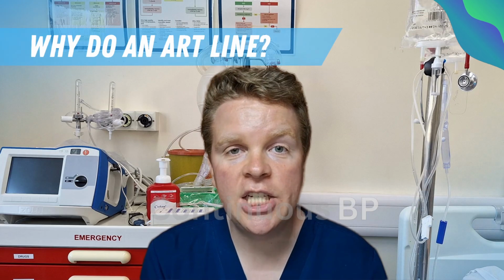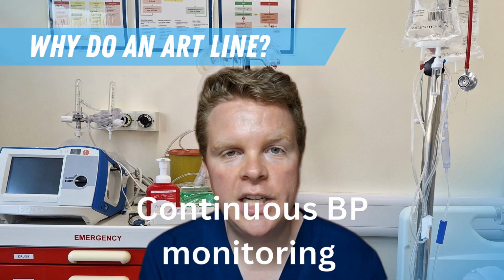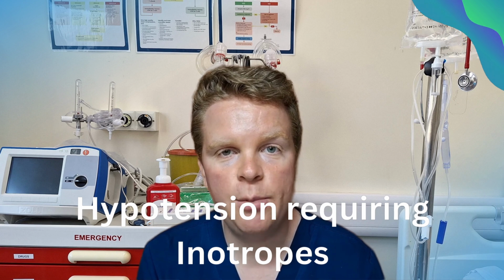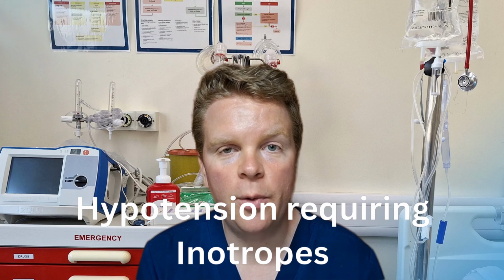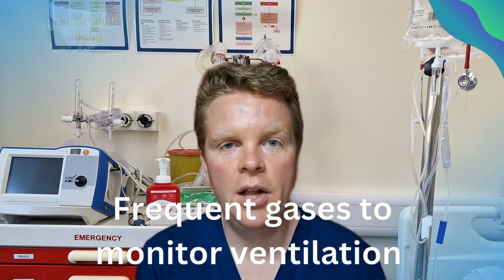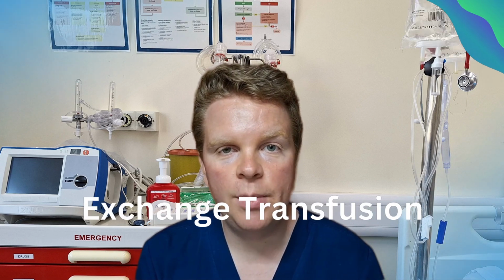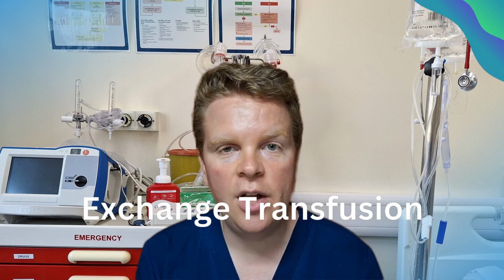An arterial line is generally required in babies that are critically unwell and require continuous monitoring of their arterial blood pressure. For example, a baby with severe persistent pulmonary hypertension of the newborn. It is also required for babies that have persistent hypotension requiring inotropes. It's required for babies that will require frequent sampling for their oxygenation and ventilation. For example, a baby on high-frequency oscillating ventilation. Finally, it is indicated for babies that require an exchange transfusion, as the arterial line is vital in removing blood from the baby.